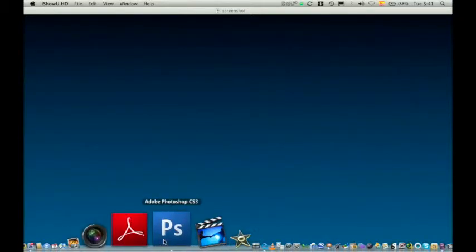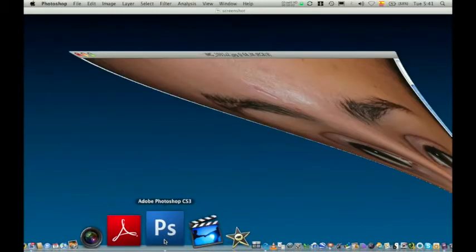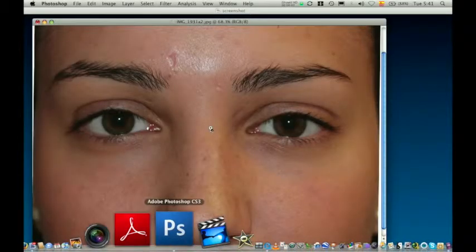The following video demonstrates the method employed to detect and measure lower eyelid asymmetries using the program Photoshop CS3 Extended.